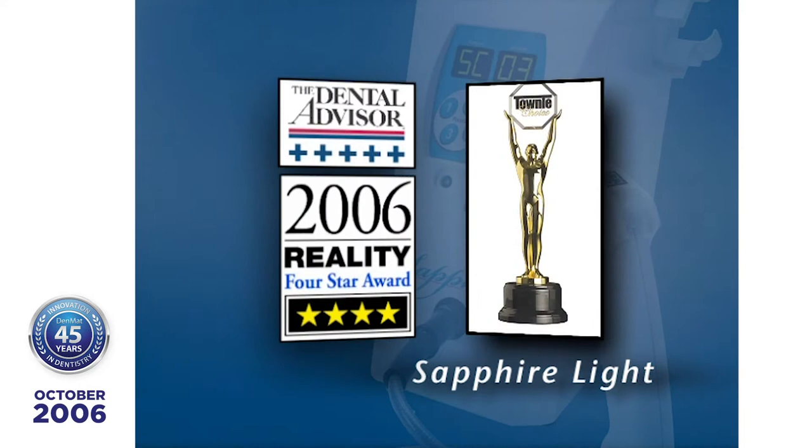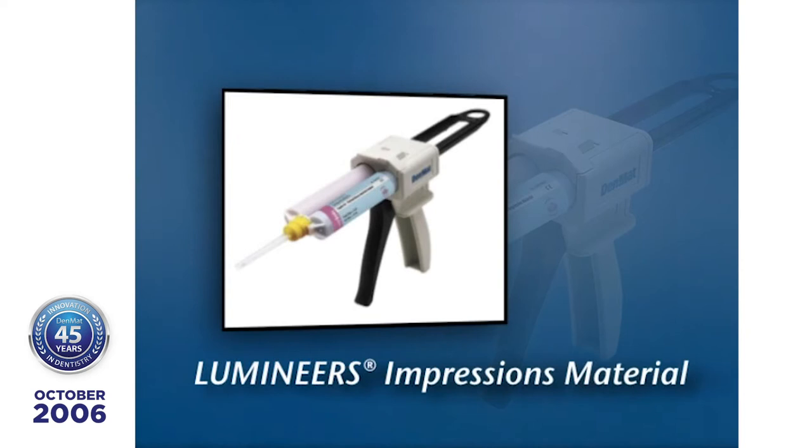Another very important critical factor is having a good model. What we recommend is the Lumineers impression material, because it's very low in viscosity in that yellow batch, and you can drive it up there, and it gives you razor sharp margins without having to do any gingival retraction.